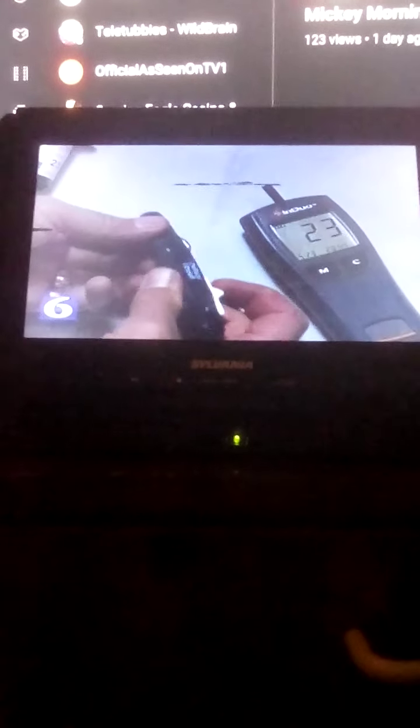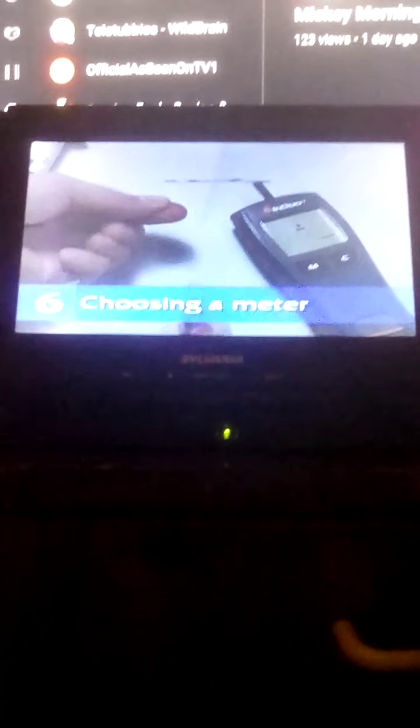Today's blood glucose meters and lancing devices make it easier and less painful to check your blood glucose. Here are some tips to help you choose the meter that is best for you. Make sure that you can clearly see where the blood sample goes on the test strip, and make sure you can read the buttons and display window. If you have vision problems, there may be meters that are easier for you to use and let you hear the results.